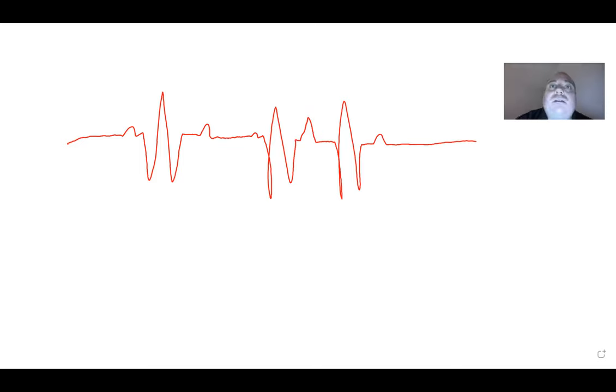If it looks like every other T wave, well, then it's probably just like every other T wave. But if it's a good bit bigger than every other T wave, then you probably have a P wave that got buried inside of it because it happened at the same time. So that would be a PAC still. Some people confuse PACs that have P waves buried in T waves as PJCs, which we're going to talk about here shortly.